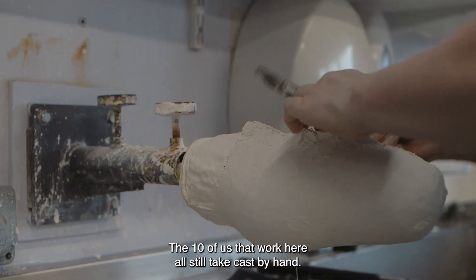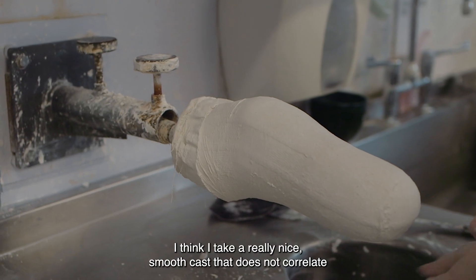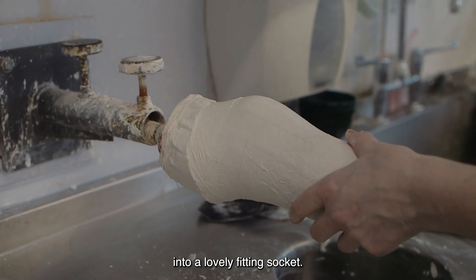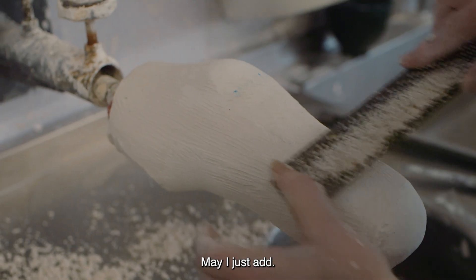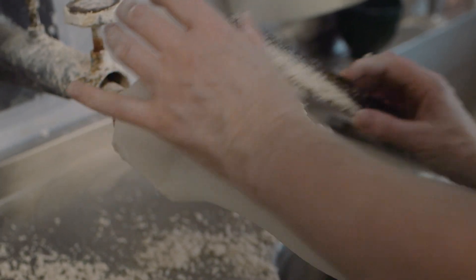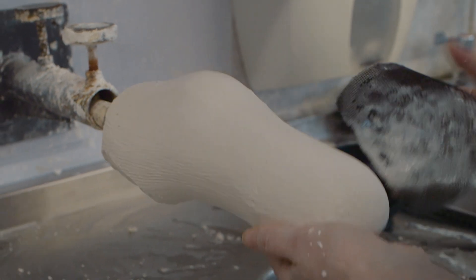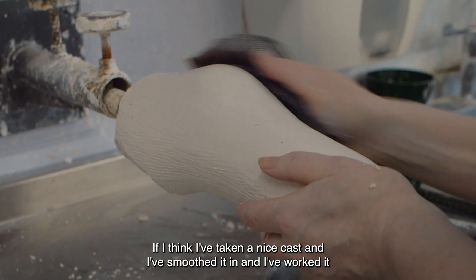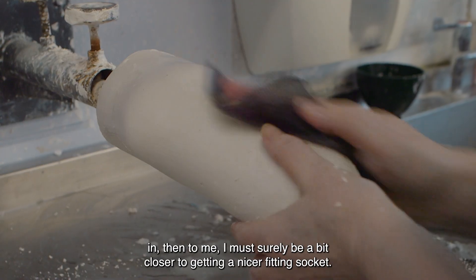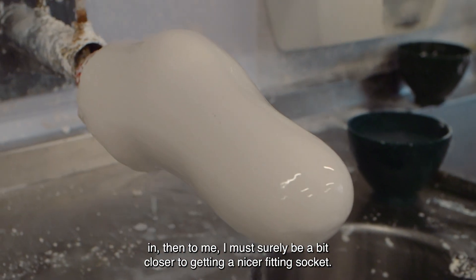The ten of us that work here all still take casts by hand. I think I take a really nice smooth cast — that does not correlate into a lovely fitting socket, may I just add. But if I think I've taken a nice cast and I've smoothed it in and I've worked it in, then to me I must surely be a bit closer to getting a nicer fitting socket.